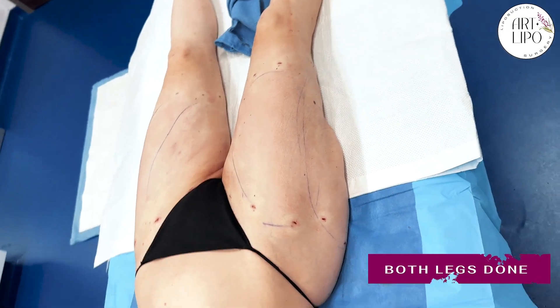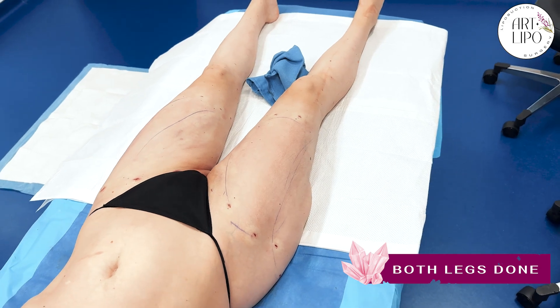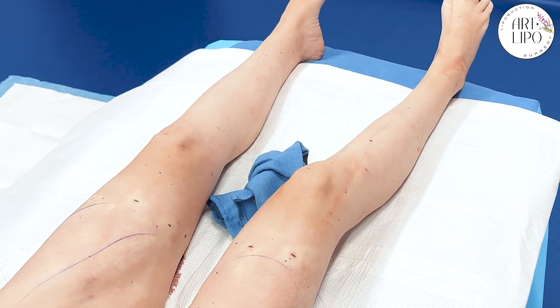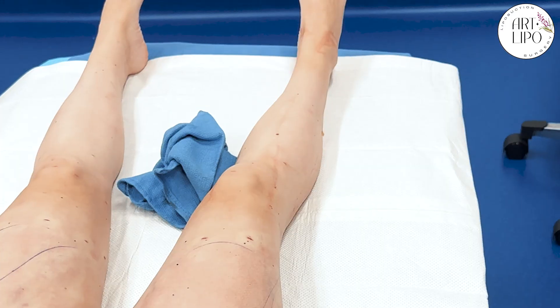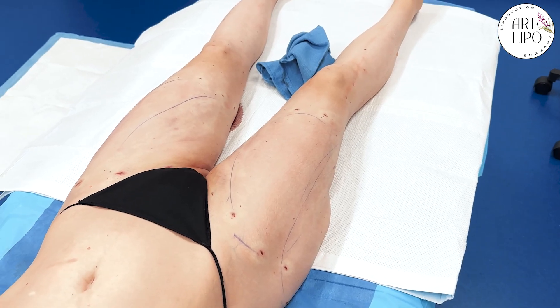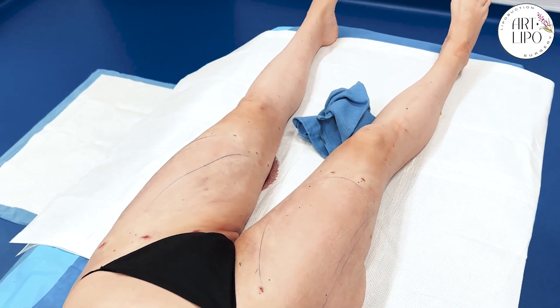Alright everybody, we are now complete with both sides. How are you doing, Kelly? Really good. Tired. It's a workout, right? Yes. It's a workout for both of us — one of the secrets, maybe not that much of a secret, is that we have everybody hold their muscles tight in all sorts of different positions for the extra control and accuracy that achieves. So it's a bit of a workout — a boot camp.